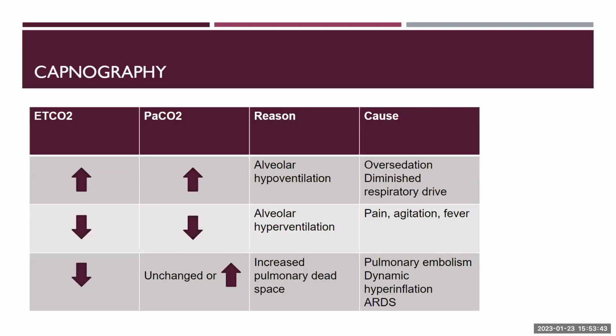So if you have increased dead space... Oh, yeah, I had a question. Oh, okay, sorry. I think I actually misheard something about the first graph, so never mind. Well, we can clarify it if you want to ask it. We have time to. Oh, this slide actually clarifies it, because I had thought that when both were high, that was like a pulmonary embolism situation, since I thought that's something I had heard, and then when Minju was saying a dead space thing, I was like, oh, wouldn't that be this graph? And then this table clarifies that. So yes, definitely misspoke. So it's definitely more of the mismatch between the two. That's more of the pulmonary embolism and the ARDS.